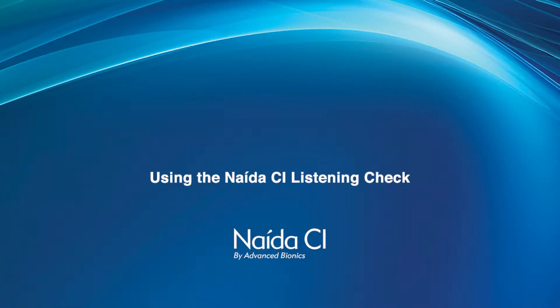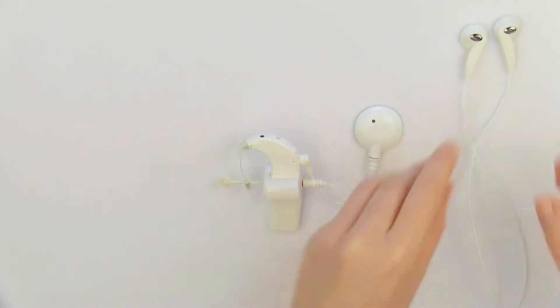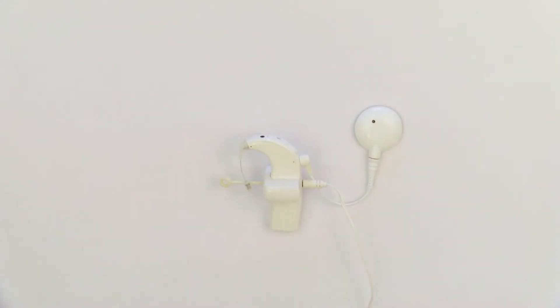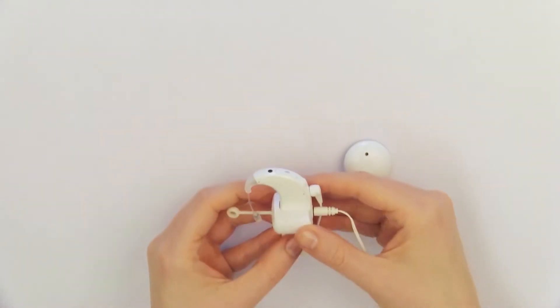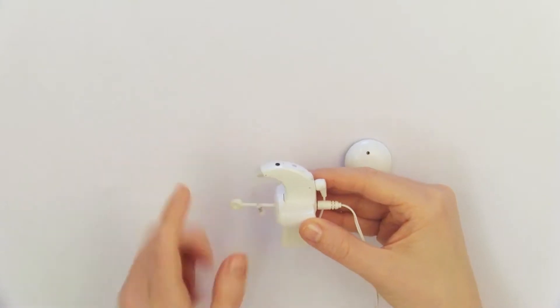Using the Naida CI Listening Check. When the Listening Check module is attached, the processor immediately enters Listening Check mode. It is a good idea to listen to the other program's Sound Source configurations to confirm each is working properly. If you are not using a MyPilot to select the input Sound Source, you will be listening to the input Sound Source configuration of the first program.